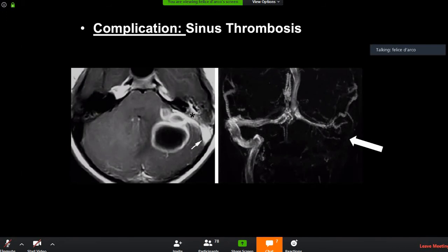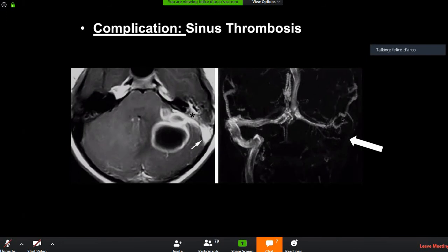Our protocol is based on MRI, MRV, and MR with contrast. We do contrast because if you do a 3D gradient sequence — like the stealth sequence neurosurgeons use pre-operatively — the veins will be full of contrast, giving you a CT venography-like appearance. MRV without contrast can fool you due to acquisition plane issues, technical settings, or the evolution of the thrombus.